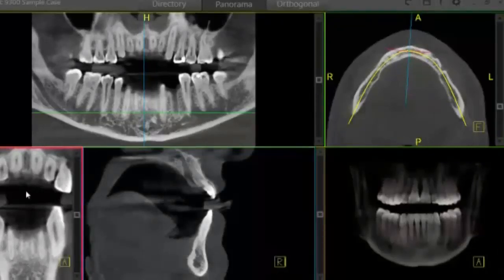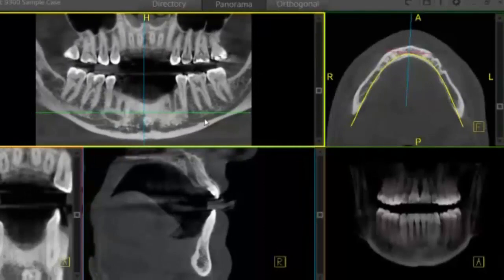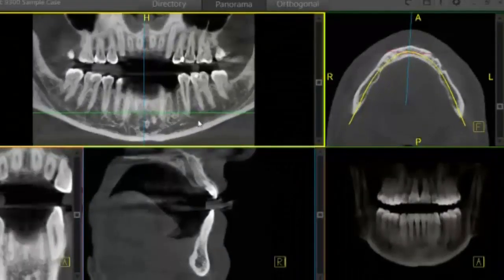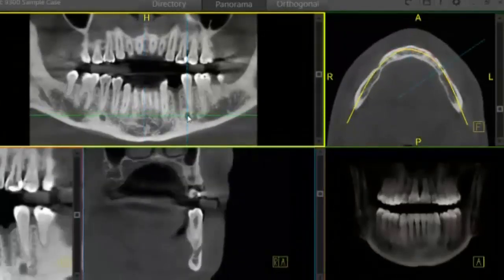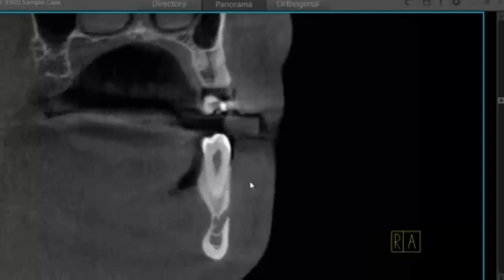Before we start to plan our implant, I want to go ahead and map our nerve. I can roll through my slices here — you can see the nerve canal. I'll roll up until I see the mental foramen, click right in the center, and it aligns all of the views, most specifically my cross section. That's where I'll start.